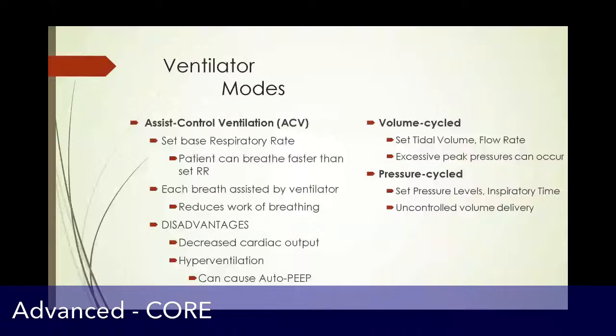So the disadvantage of this is that with a ventilator assisted breath with every single inhalation, you have the possibility of increasing pressure within the chest. This is going to decrease cardiac output, and ultimately can cause lung injury.